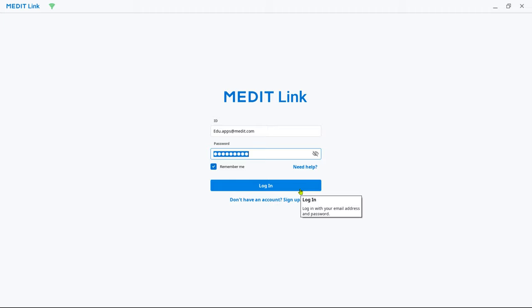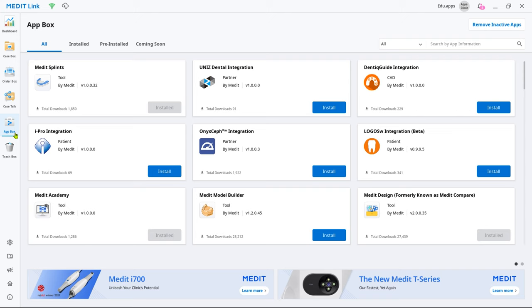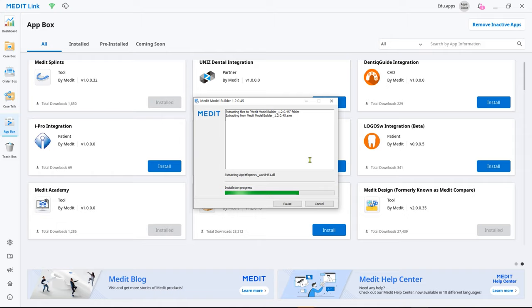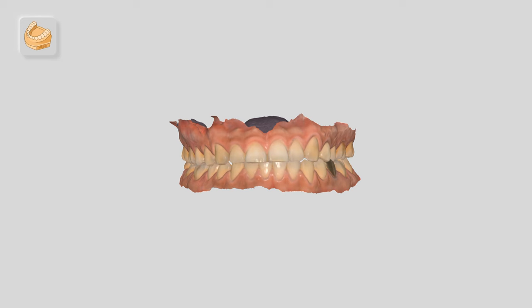Log into your MeditLink account and go to App Box, then find Model Builder and click Install. The installer will run automatically.